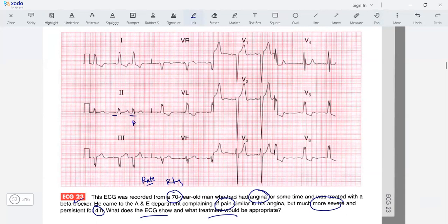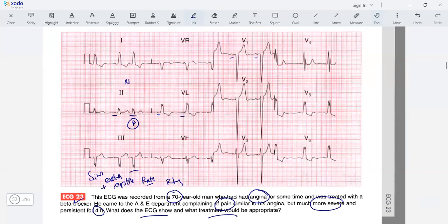Then another P wave, this is okay sinus. Seems to be sinus rhythm with some premature complexes. So sinus rhythm with some extra systoles.